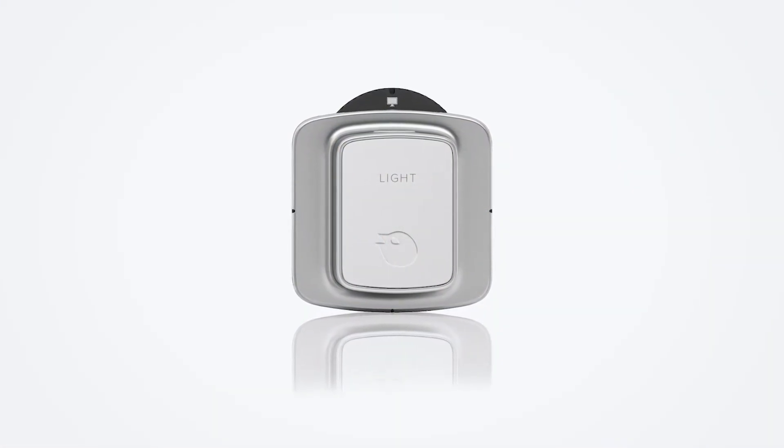Watch out for additional videos presenting other X2 sensors of the Raysafe X2.